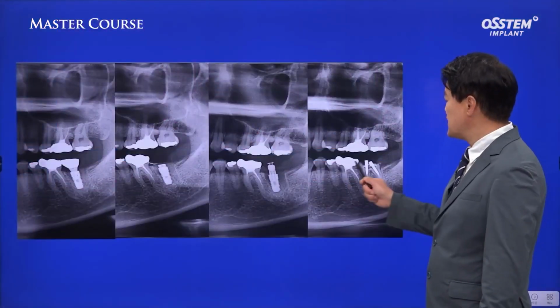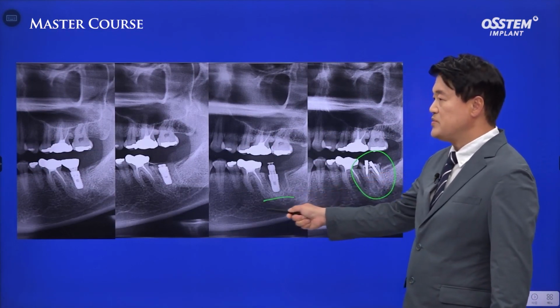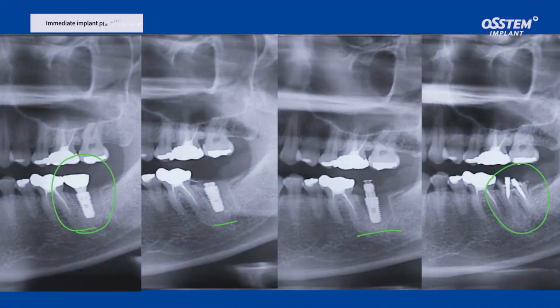This is before extraction. This is before GBR, after GBR, and after prosthesis delivery. You do not need to stick to delayed implant placement. You can get good results using this methodology.